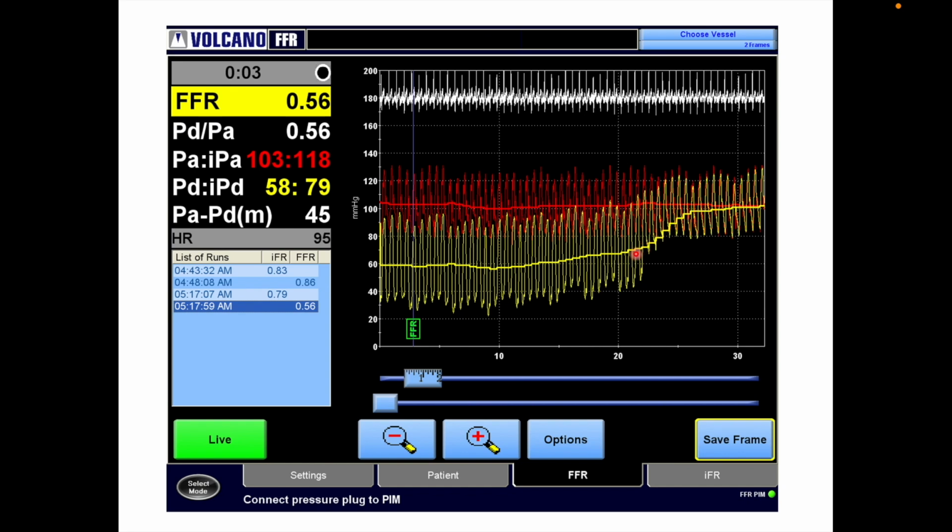How big the step up is, you can see this comes to somewhere around 70. This corresponds to this one. The lower end of the step up and the upper end of the step up corresponds to something like 95. So it's around 25 millimeters, 25-30 millimeters step up. It's a huge, big step up. So that's the most significant point.